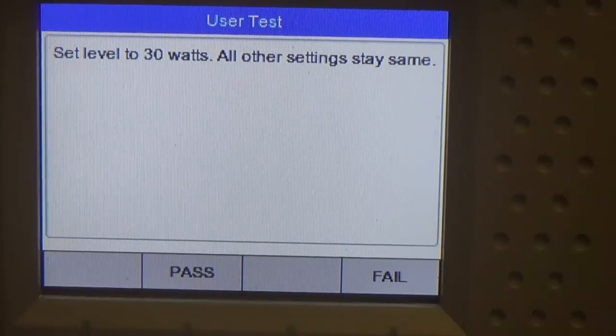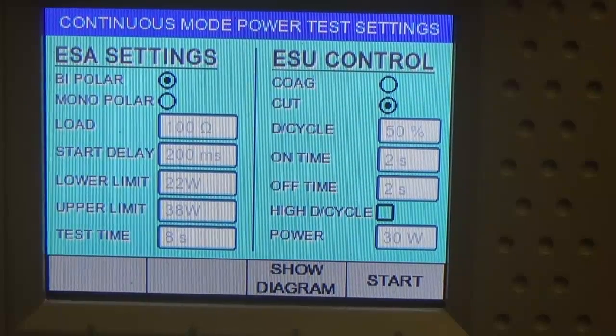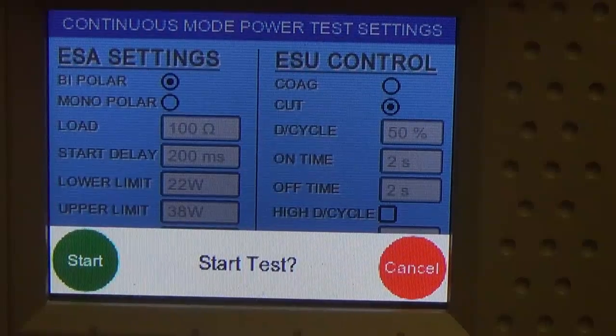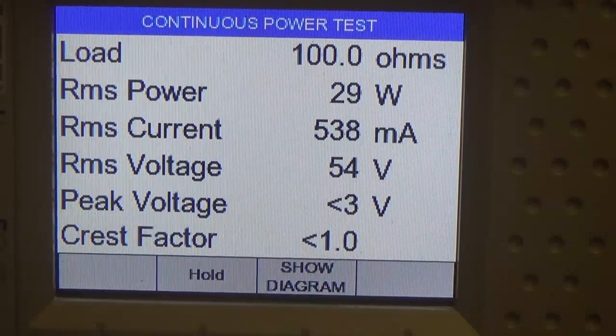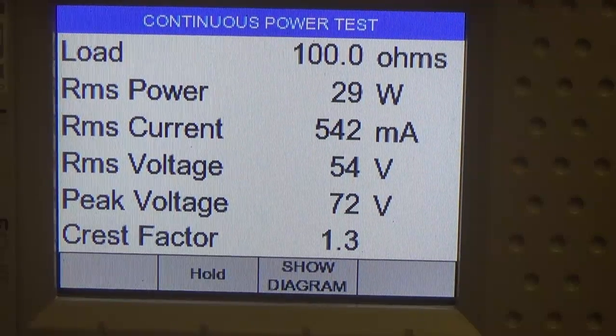I've done many of these Triad PMs, and I actually can get a Triad PM fully documented and done in 25 minutes. So we'll press the start button, the green start button, and the start RF button. Again, you'll hear the triad firing. You'll see the results appear on your screen.